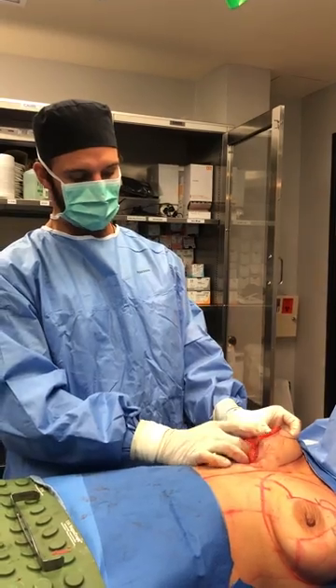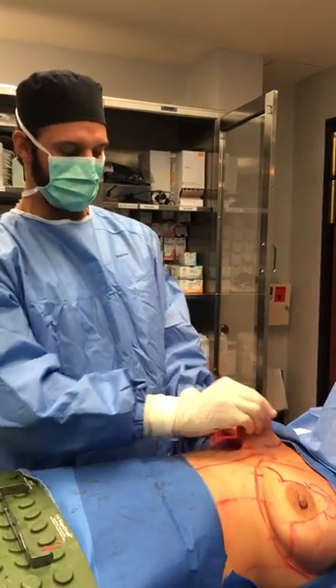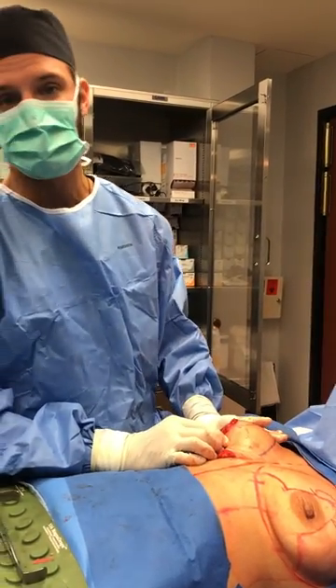The Gallashape is sewn in around this little pedicle with the nipples on. We're going to bring this around, bring the nipple-areolar complex to its new position, and we'll show you the end result.